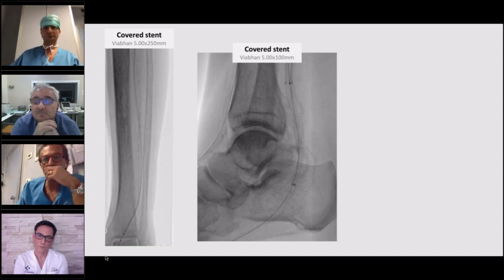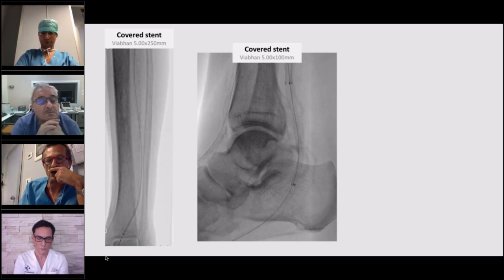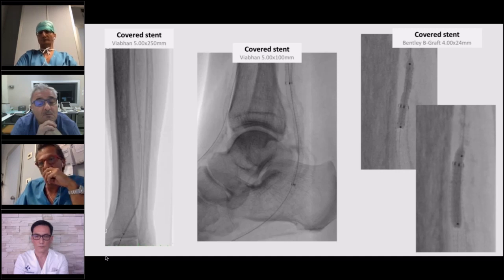And then, as I explained before, usually I go with the stent across the ligament. Then we complete the AV connection, placing at the connection point a coronary covered stent and flaring the vein portion of the stent. This is in order to direct the flow downward.